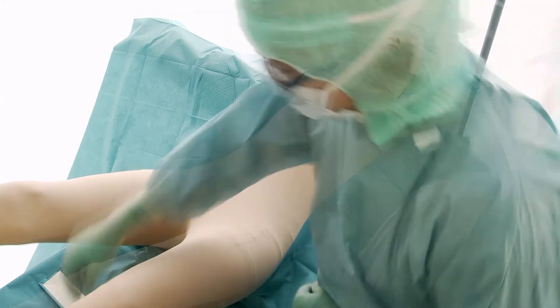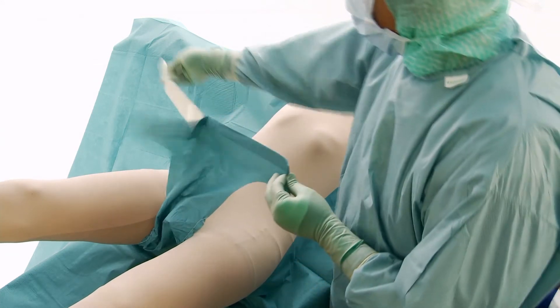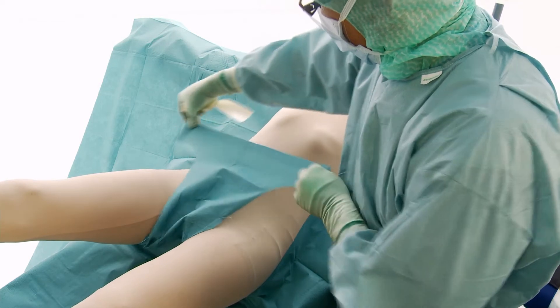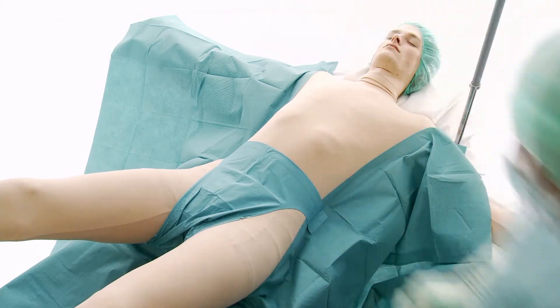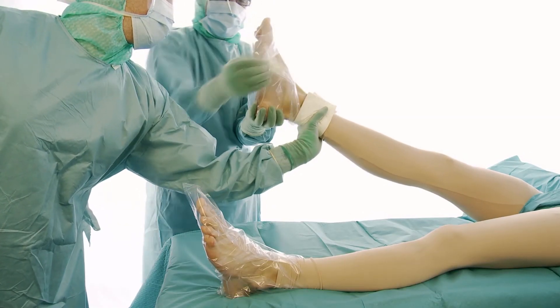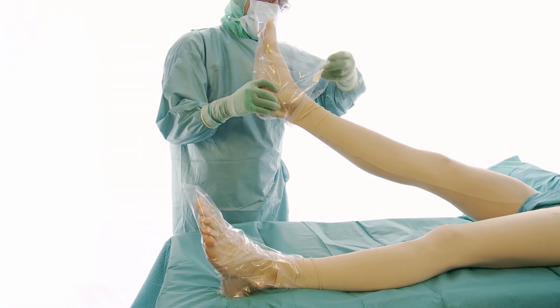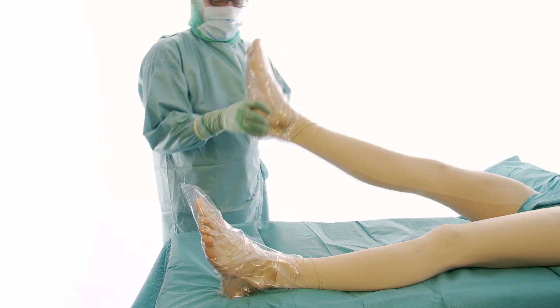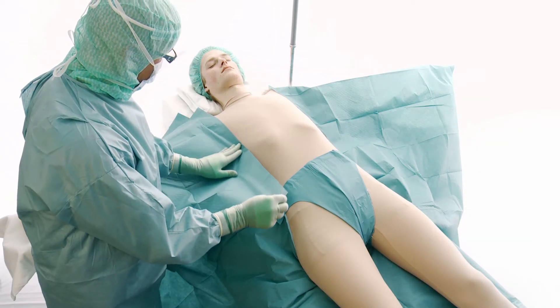Place the integrated genital cover on the patient. Then drape the patient's feet with the foot covers. Place the two adhesive towels on the lateral sides.